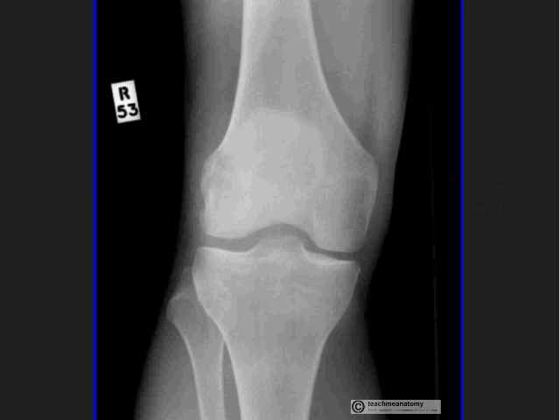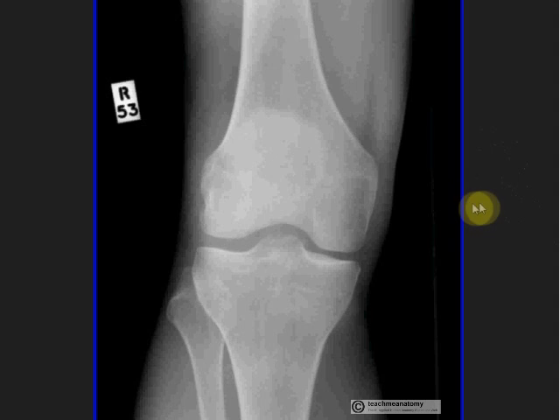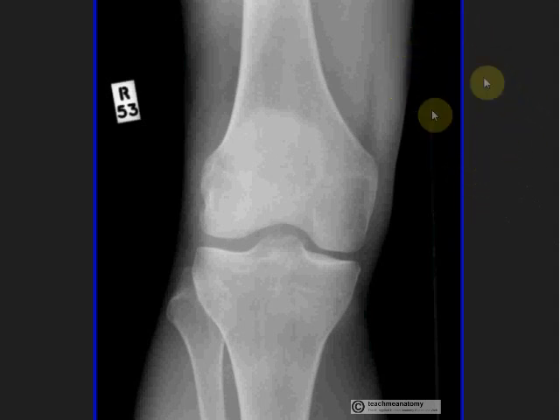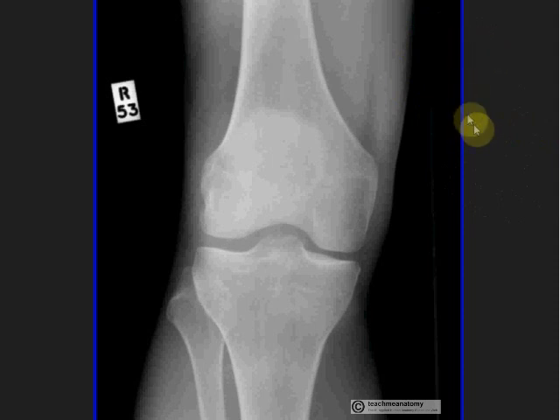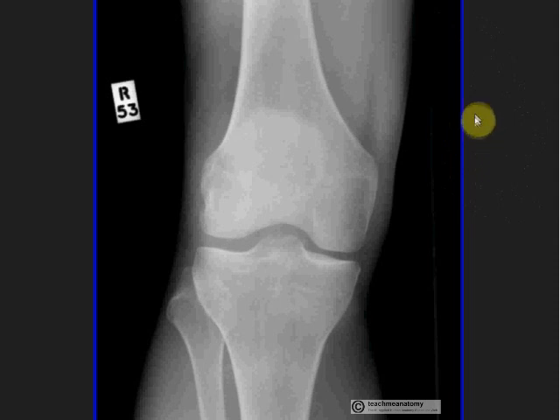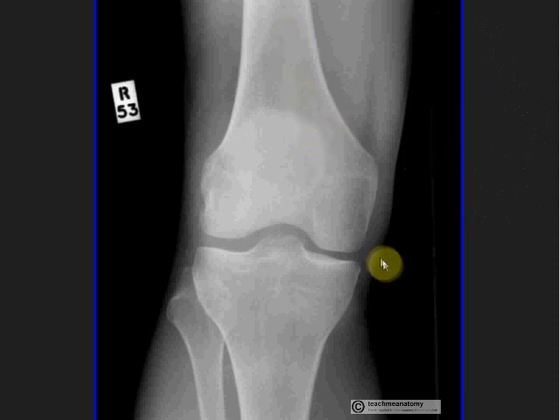So if you're dragged up by a consultant to look at an X-ray, a good way to buy time is just to go logically from the start. For example, in this case you want to look at this X-ray and say this is a right AP knee X-ray — anterior posterior — because it's basically going from the front to the back.